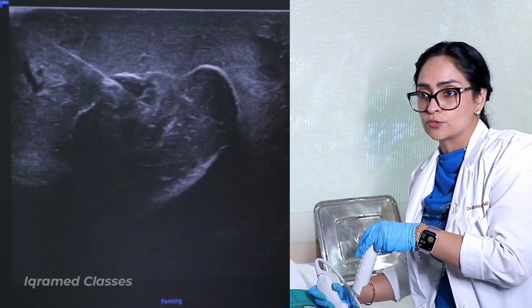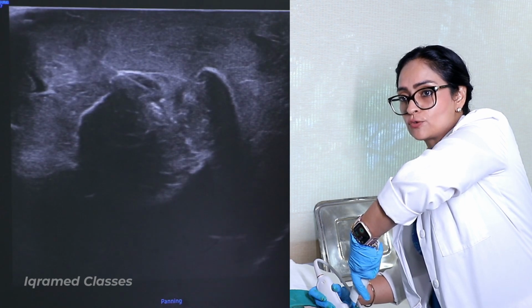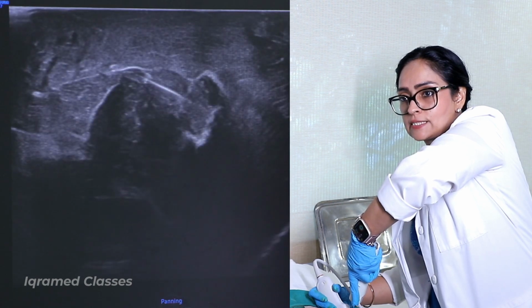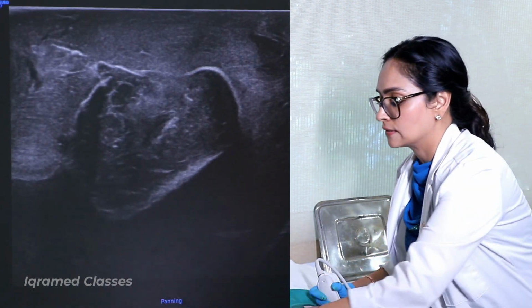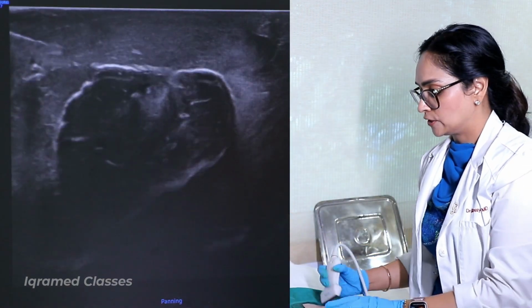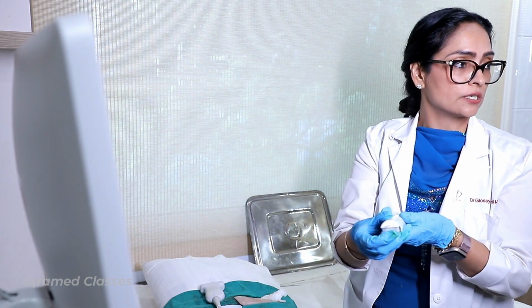Once it is inside, you will not go through and through. You will wait here, and then you will fire so that you get the tissue core from inside. And once the shot is taken, we slowly take it out like that. You can see it. That's our track of the biopsy taken. Then you will put the gauze piece, and you will see how the sample comes. It is important to see how the sample has come. We can show you here.